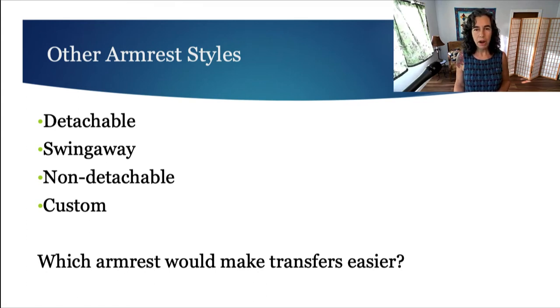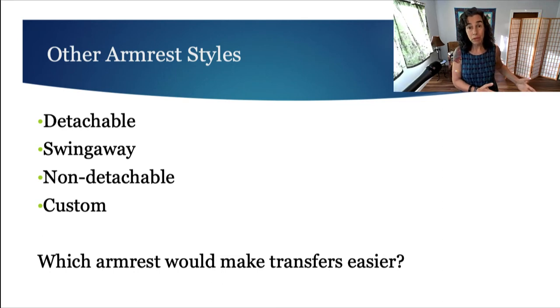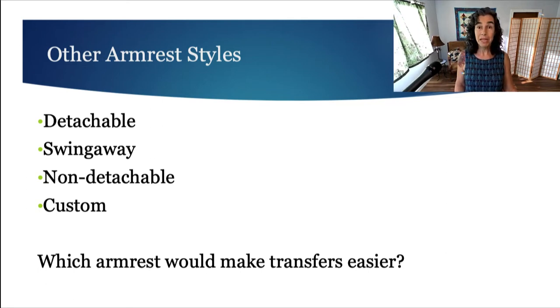Hopefully you are thinking about the fact that if you're transferring maybe with a sliding board, you're not going to be able to do that if you have an armrest. If you are standing for the transfer, it may be that the armrest is really handy for you, right? So it depends on what sort of transfer and what you're up to. So again, if you have questions or you need to see a visual of that, let me know and we'll go over it in class.